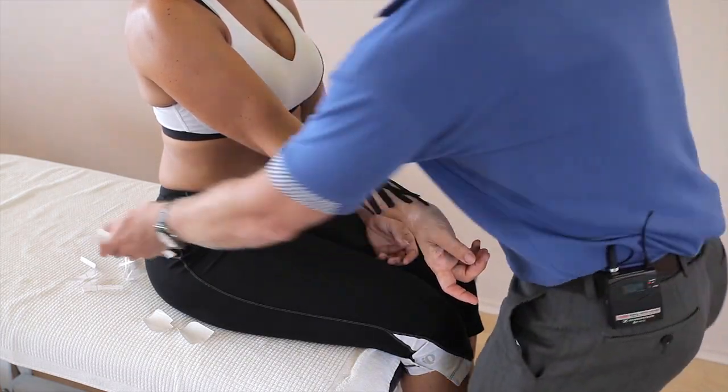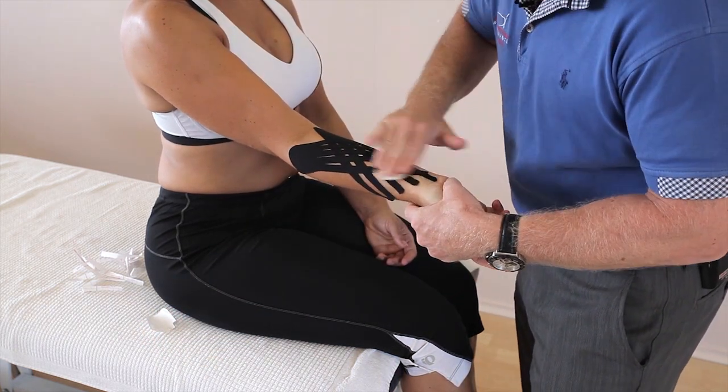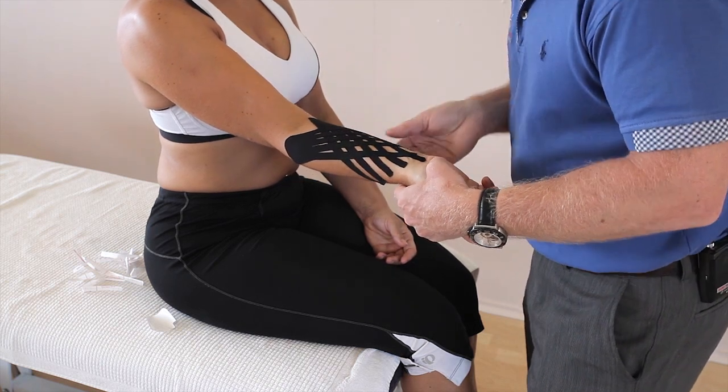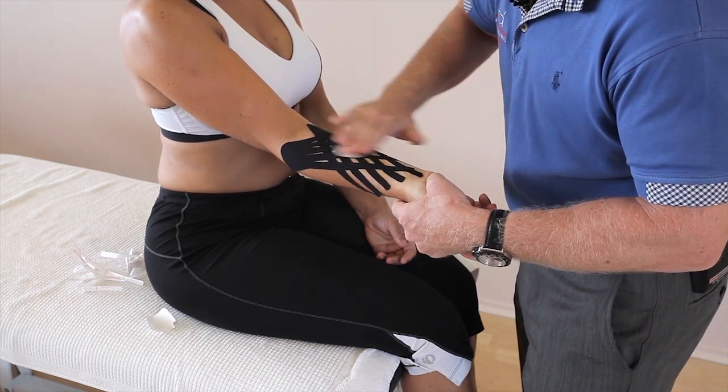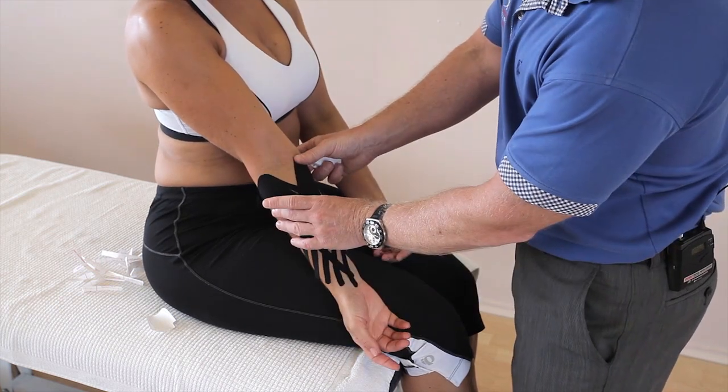Once we've done that, use the back of the tape because we need to heat activate the glue. We can leave it on for between three and five days. And there we have kinesiology taping for a flexor pump and flexor compartment syndrome.